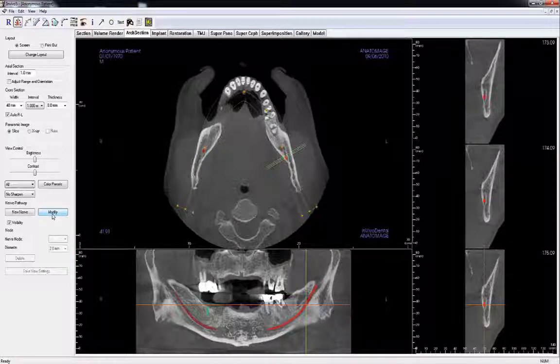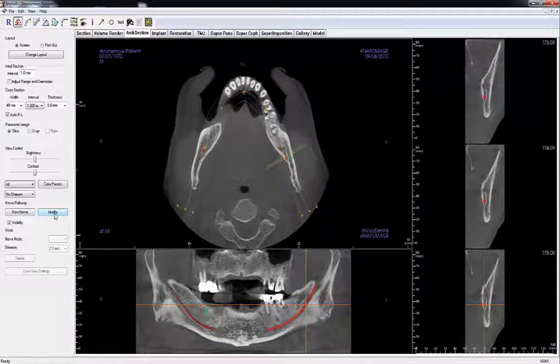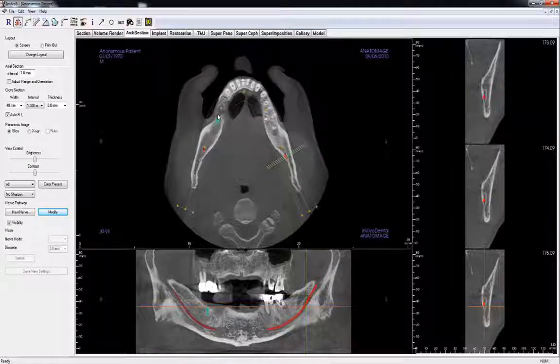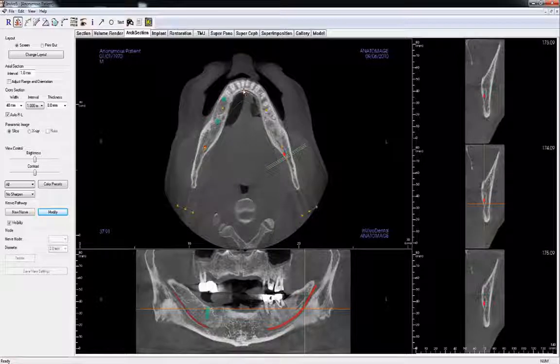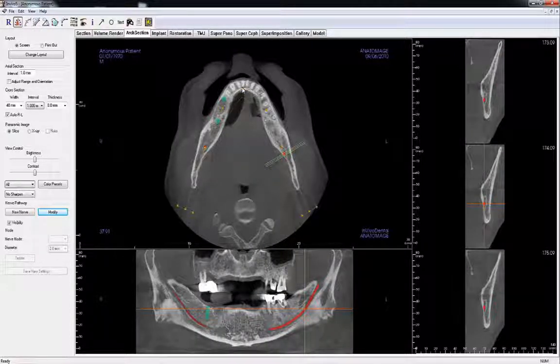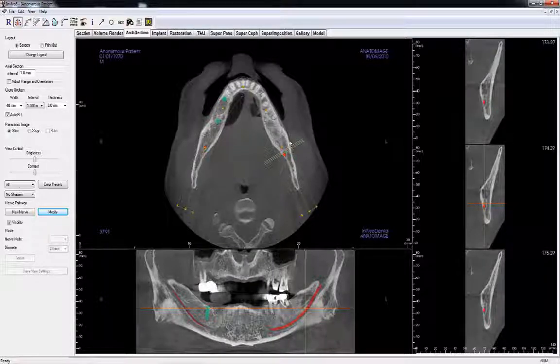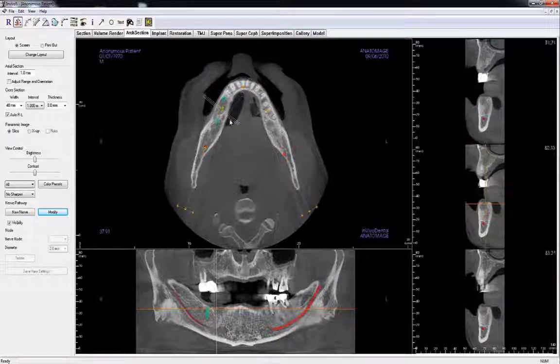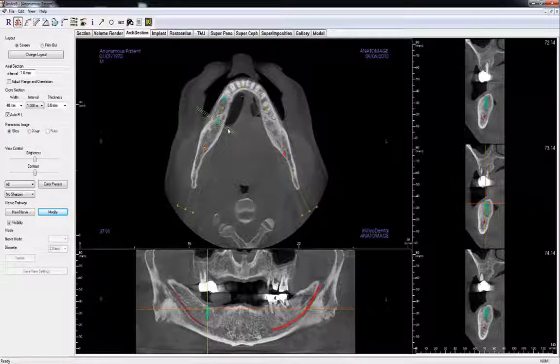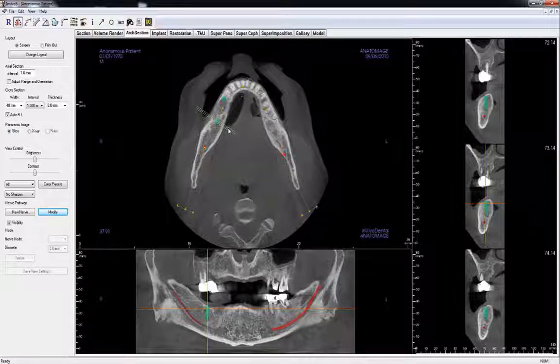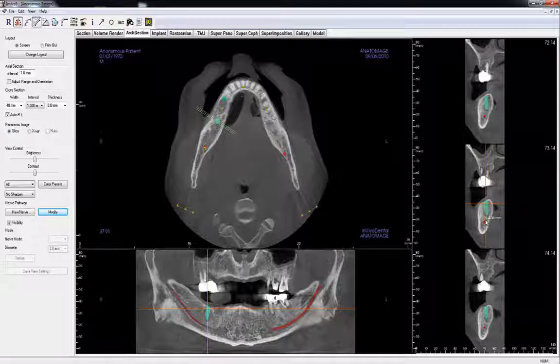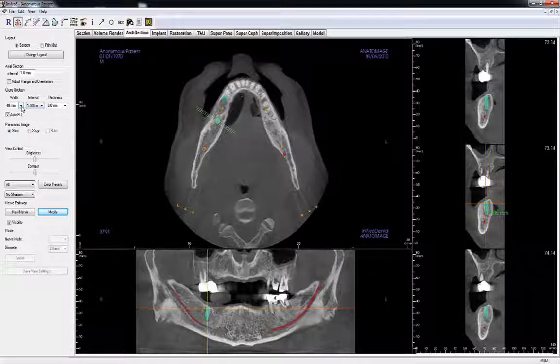Click Done when you are finished with your modifications. The Arch Section tab can also be used to view anatomy in multiple cross-sections traversing the dental arch. First check that the arch spline is parallel to the arch at the area of interest and adjust if necessary. The green lines should now be perpendicular to the arch, which ensures the cross-sections are buccolingual. This is crucial to display an accurate amount of bone and avoid oblique slicing. Using the cross-sections, we can make measurements with the measurement tool such as measuring the distance from the implant to the nerve. Additionally, we have options to modify the cross-sections with these parameters.